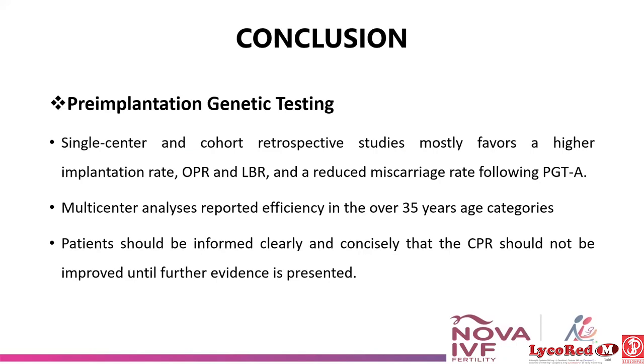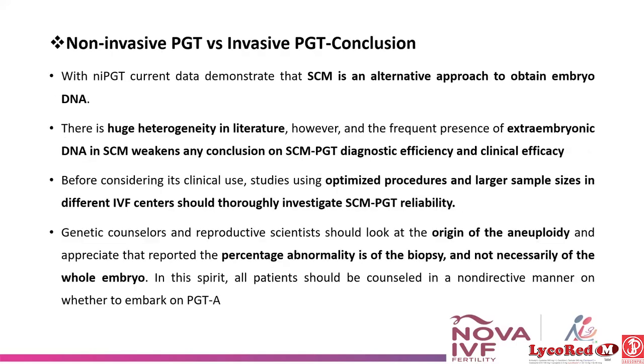Patients should be informed clearly and concisely that the clinical pregnancy rate should not be considered improved until further evidence is presented. Now, between invasive PGT and non-invasive PGT: current data demonstrate that spent culture media is an alternative approach to obtain embryo DNA. What I feel is that spent culture media is the future for PGT.